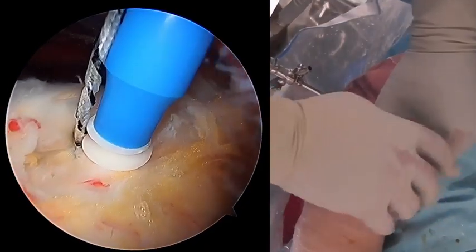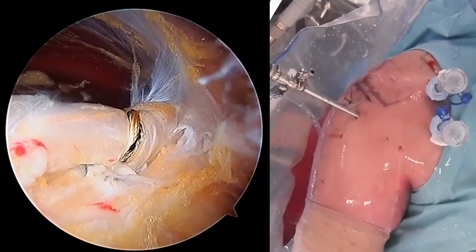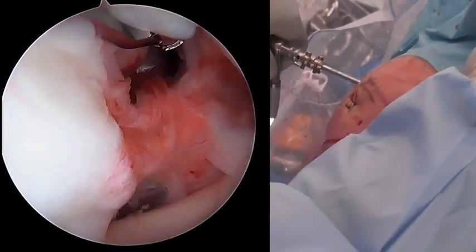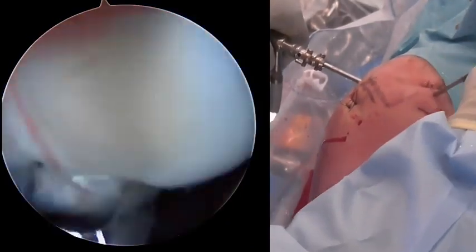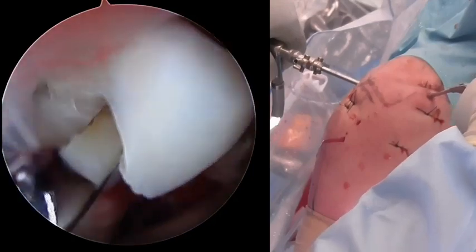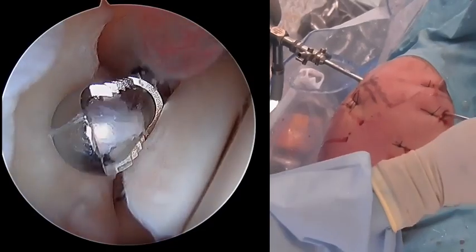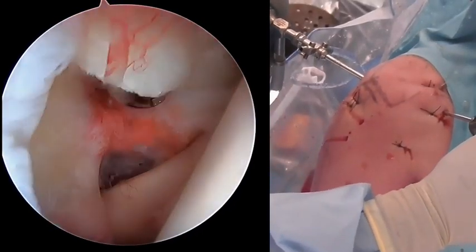The anchor is brought in, and then after that the suture is cut to length using a suture cutter. And then we shift to the glenohumeral joint, viewing from posterior and introducing an arthroscopic straight punch from anterior to release the biceps tendon at its insertion. A shaver is then used to remove the stump of the biceps tendon from the glenohumeral joint.